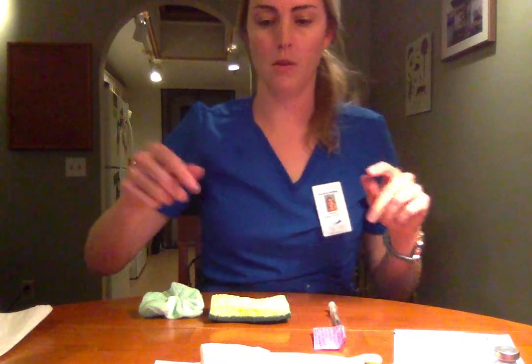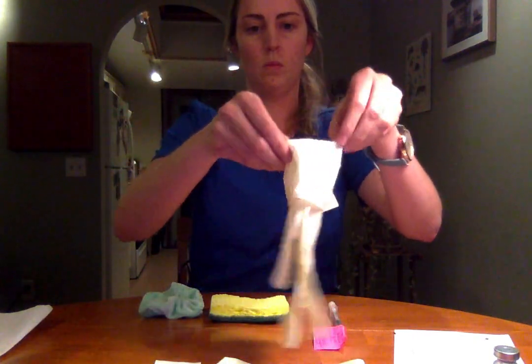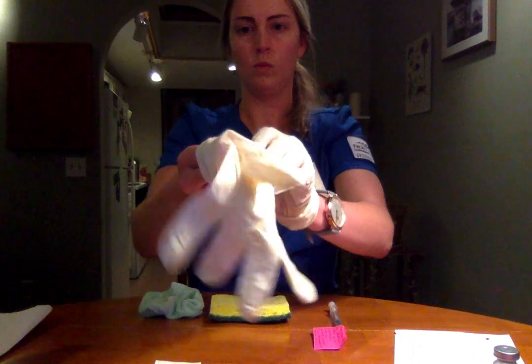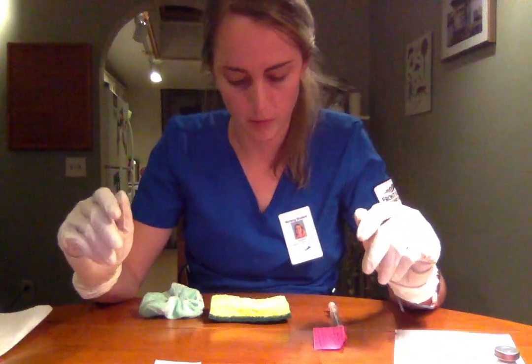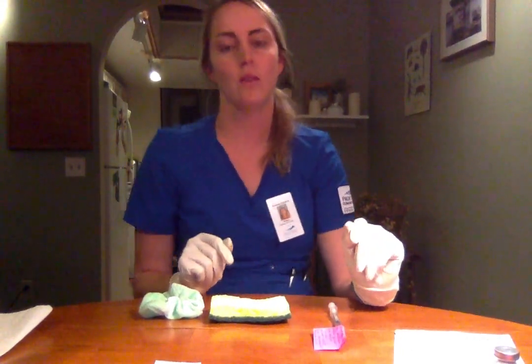Alright, so I'm going to put on my gloves. Okay, so I have my gloves on. Now I'm going to locate my site of injection.